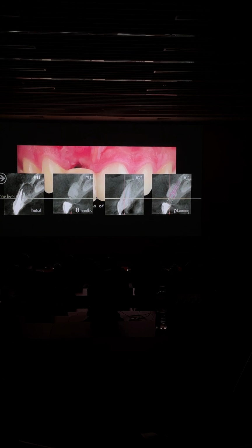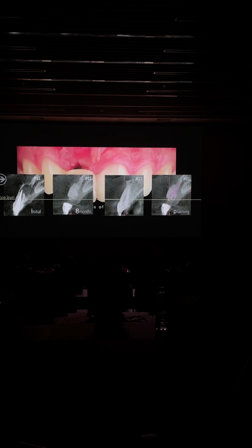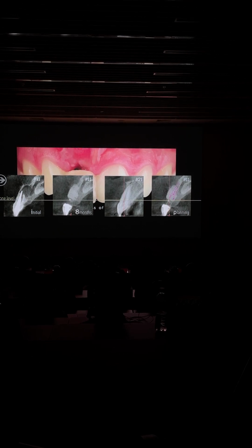It will withstand any pressure that I will create placing my tissue crestally. So it's a good way of finishing the case. You can see I have enough bone to really place 3.5 implants, which is my best option when it goes to delayed implant placement.